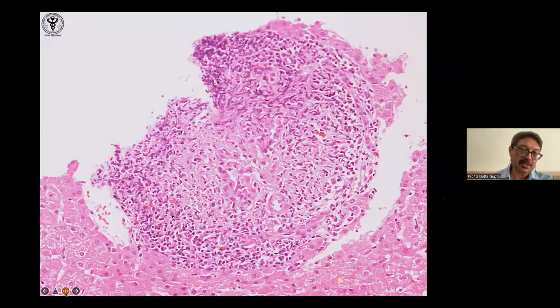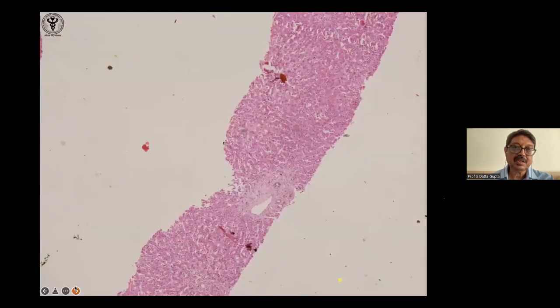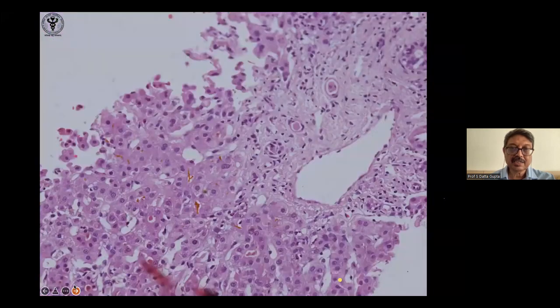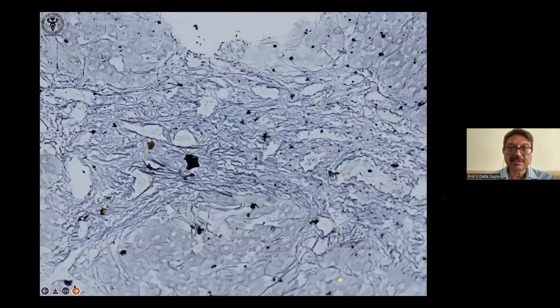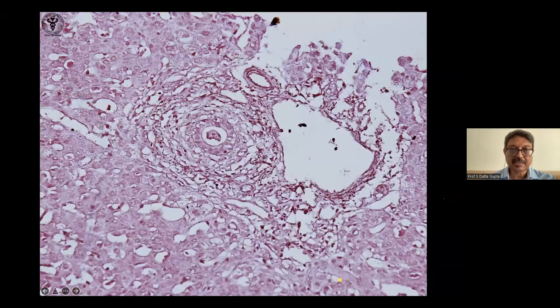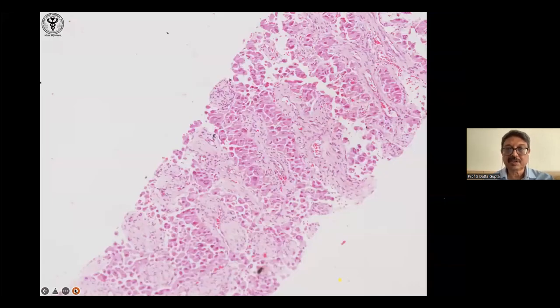You can get a granuloma in tuberculosis also, in sarcoidosis also, right? So the clinical finding is very important. Another obstructive jaundice: you're finding the bile duct there, but if you keep searching, there's some loss here and cholestasis. And if you see here, there is this onion skinning. So you can say it is suggestive, and there is this orcein stain with these brown things, which are copper binding protein, consistent with primary sclerosing cholangitis.